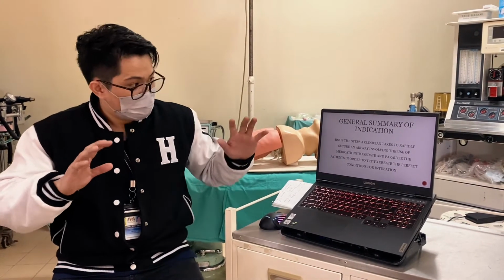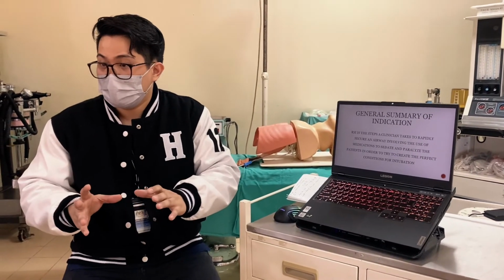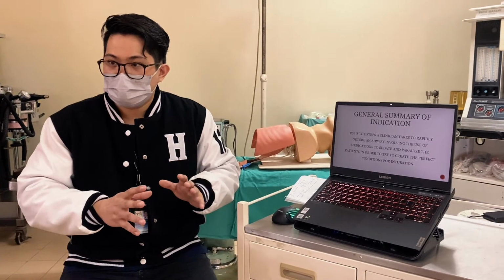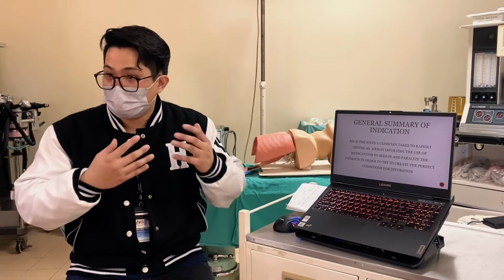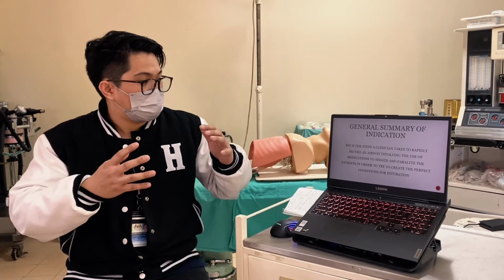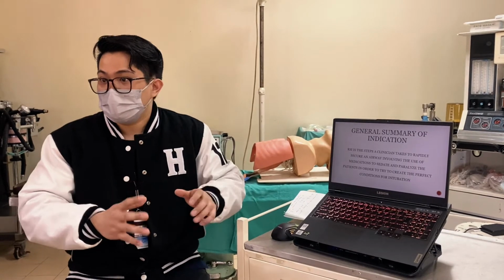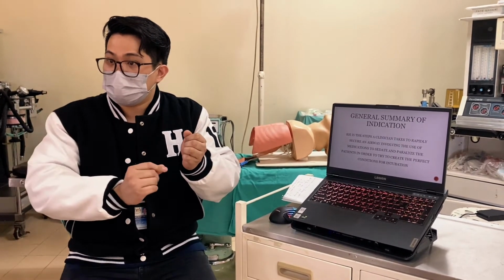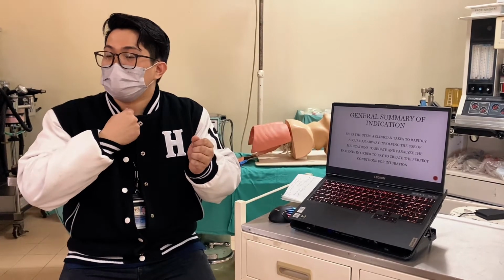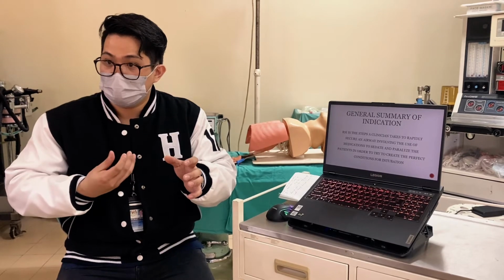When we know the indication and which patient we can target for RSI, then we can do our part to create the perfect environment to intubate the patient, putting an endotracheal tube past the vocal cords into the trachea, so that we can ventilate as normal. Okay.